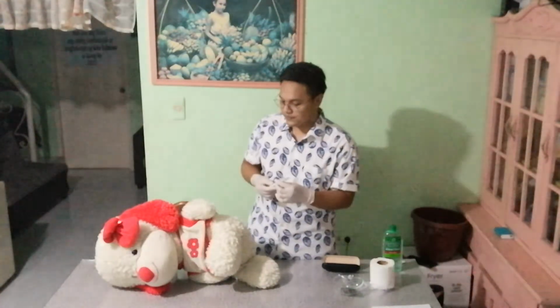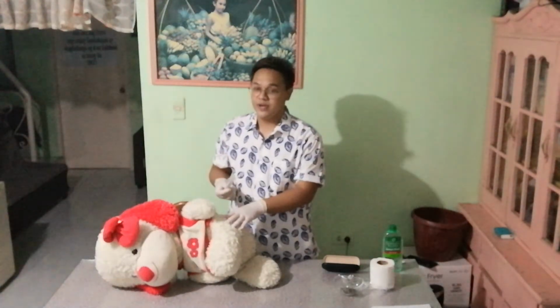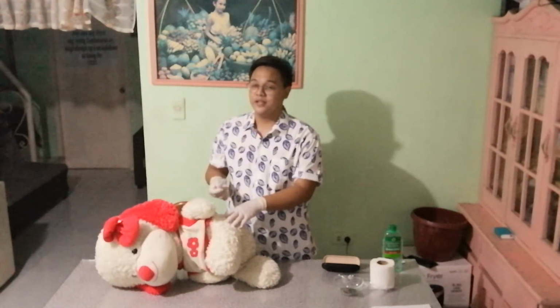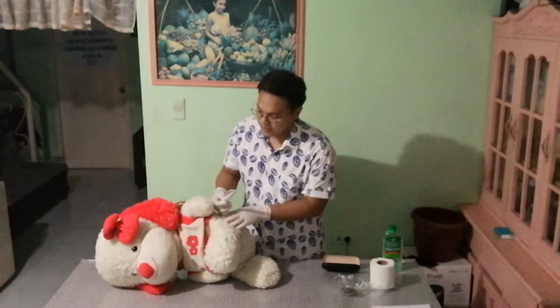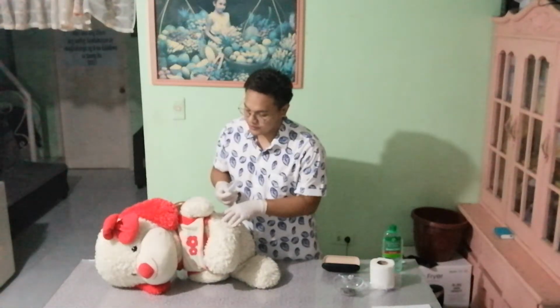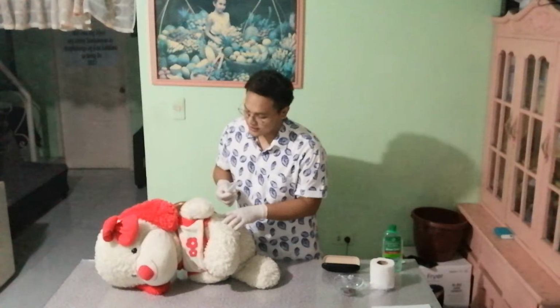So for our fifth step, we need to reassure the patient and separate the buttocks until the anal sphincter is visible and can clearly be seen. Ma'am, I will now proceed in the insertion of the thermometer in your buttocks area. So please relax.